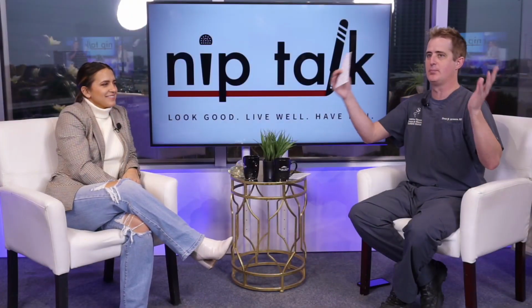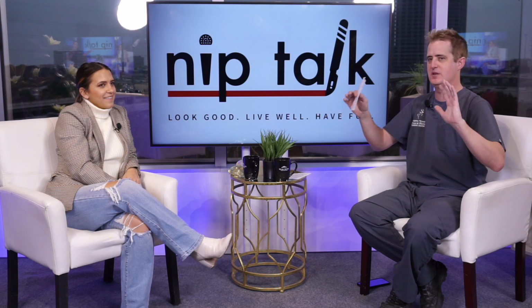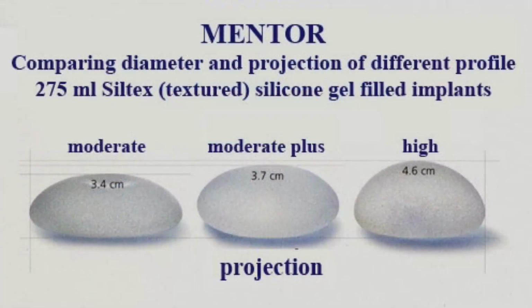All right, so the last thing is implant style and profile. I did bring a picture. This is the best picture to show. Basically the style or profile is how wide the implant is for a given volume. So this is a 275 implant. If it was a moderate profile, it'd be more flat. Moderate plus is a little bit narrower but fuller, and then high would be even more narrow with more projection.